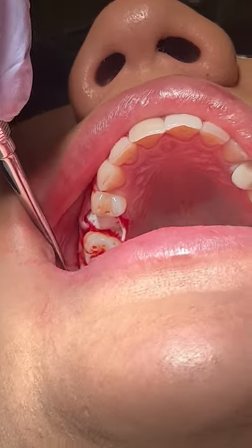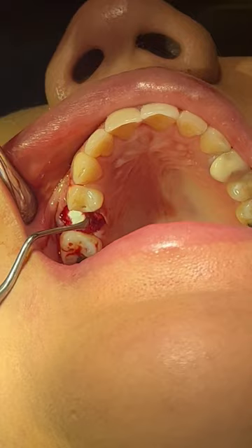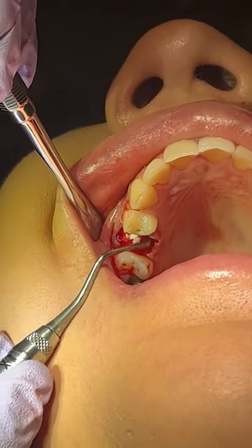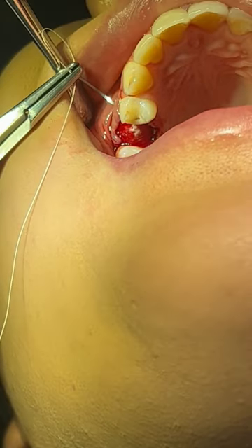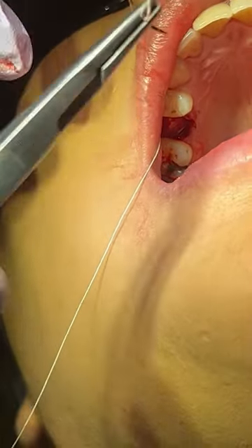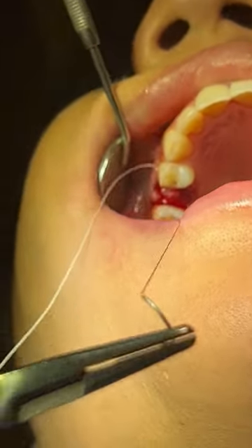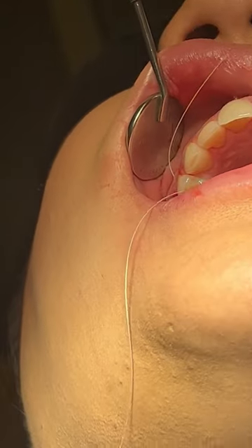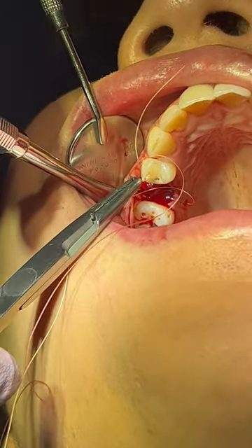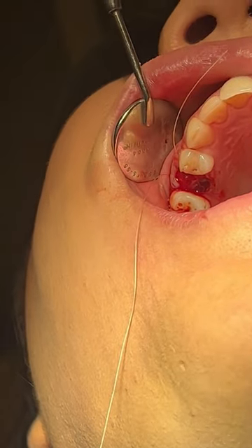Then I tuck in my membrane, both on the buccal and lingual. Here comes the serrated curette again — I love using this serrated curette, it just makes my life a little easier. Once everything is nicely tucked in, I take my vicryl suture and begin the process of suturing. The key to any suturing technique is take big bites — at least two to three millimeters, if not four millimeters of a good bite — to make sure that whenever your patient is healing and the tissue swells, it puts compression on your sutures. The suture might work its way out a little bit, but if you're taking a big enough bite, the suture will stay exactly where you put it, allowing that area to heal beautifully.